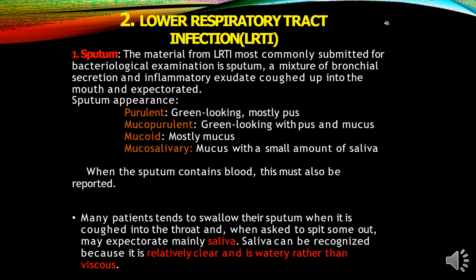Many patients tend to swallow the sputum when it is coughed into the throat, and when asked to spit out something, it is mainly saliva. Saliva can be recognized as relatively clear and watery rather than viscous.